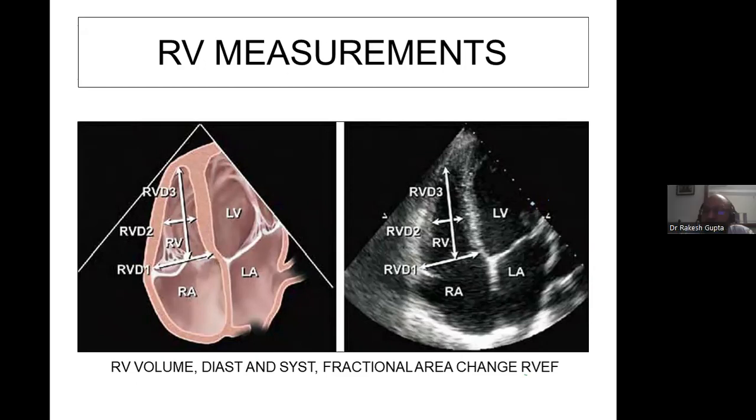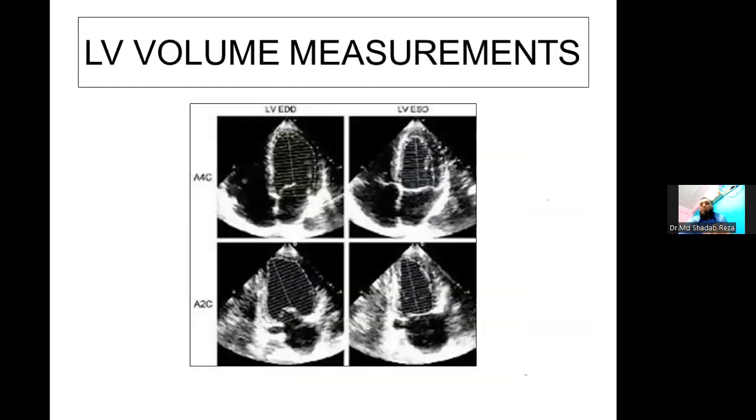Dr. Mohammed Sadab Reja. Yes, good evening, ma'am. Ma'am, you told us that during left ventricular measurement, in two-chamber views, you look for the apex. Can you explain again, ma'am?